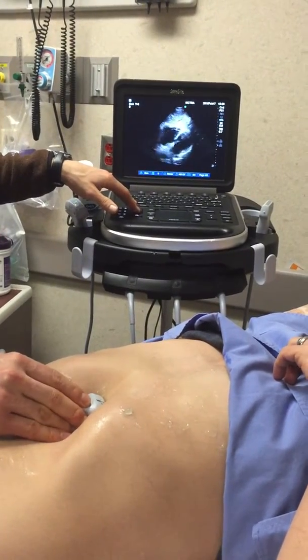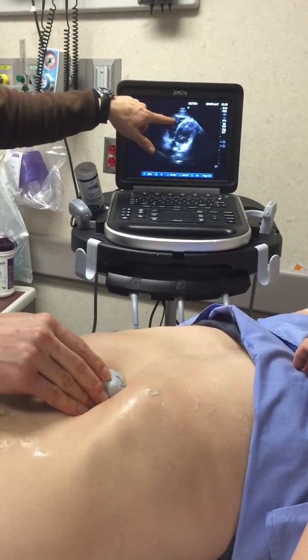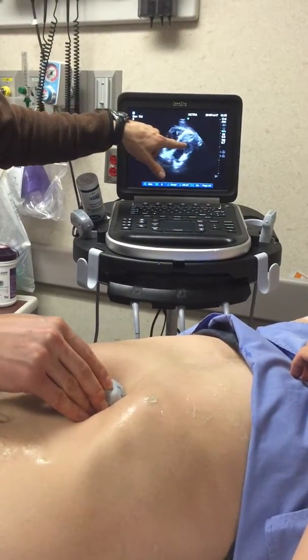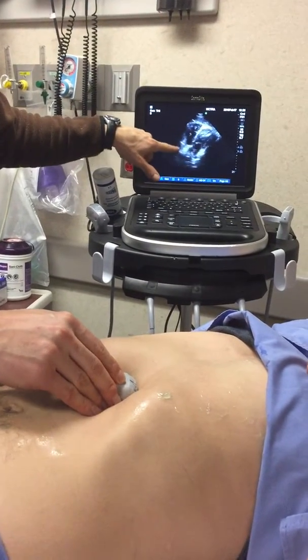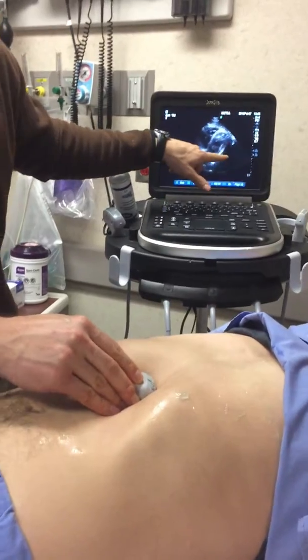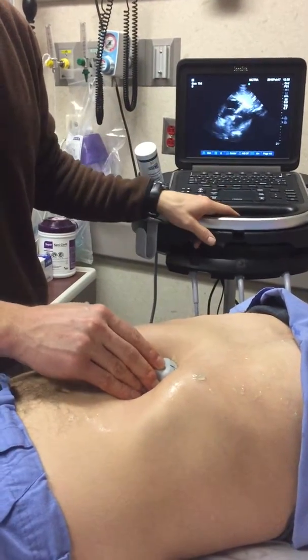And then on the screen here, take a breath and hold it, please. Good. And you could see the right ventricle right near the liver, the left ventricle, and then the corresponding atria below. You would see dependent pericardial effusion in this view down inferiorly. You can breathe. Those are your 4 basic views of the heart.